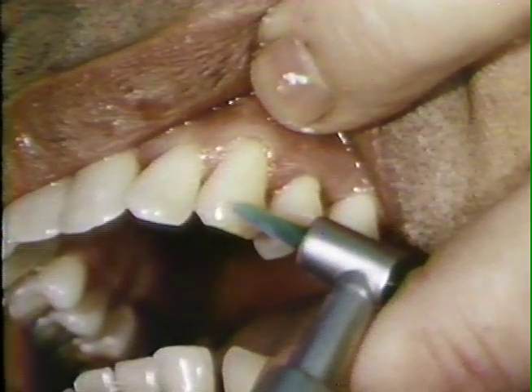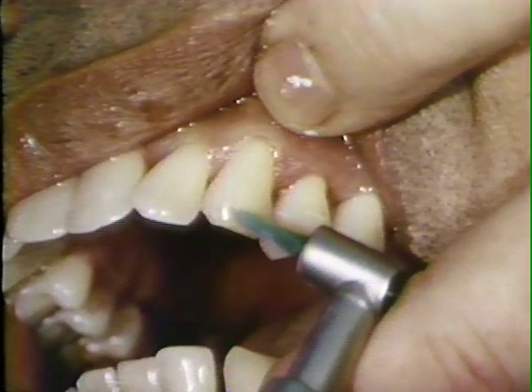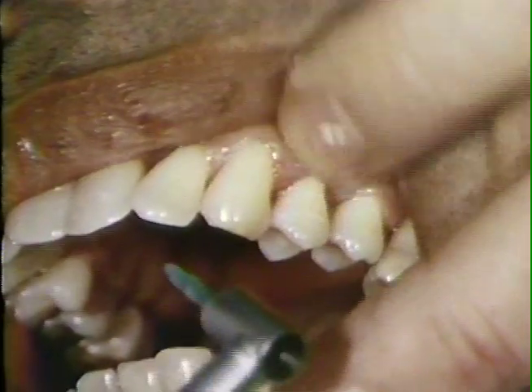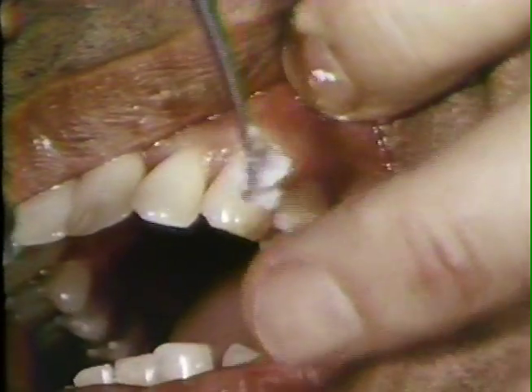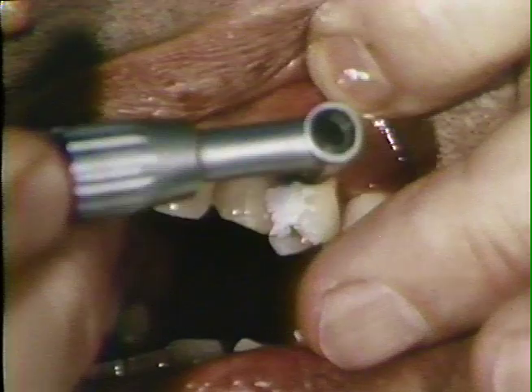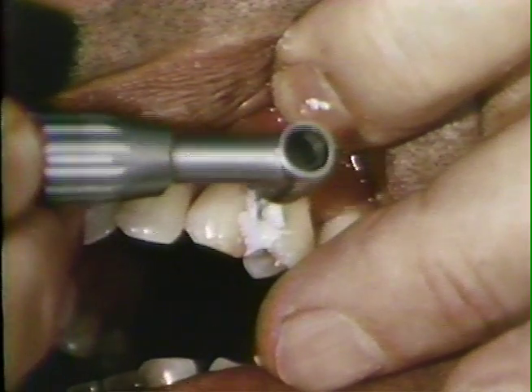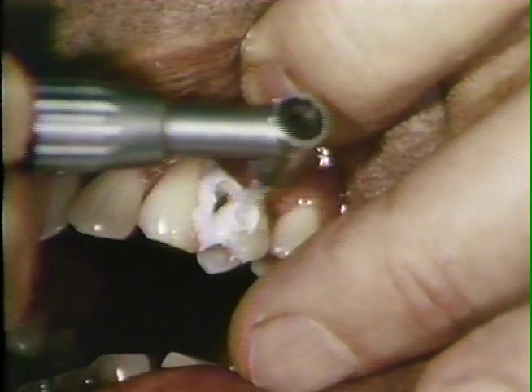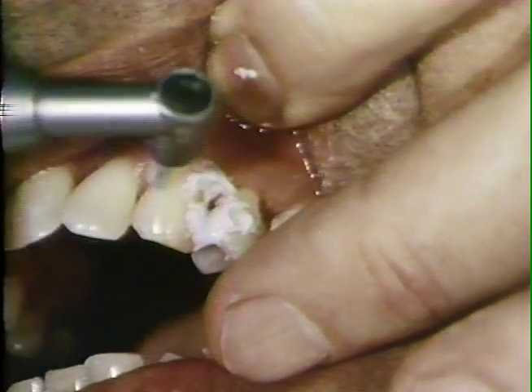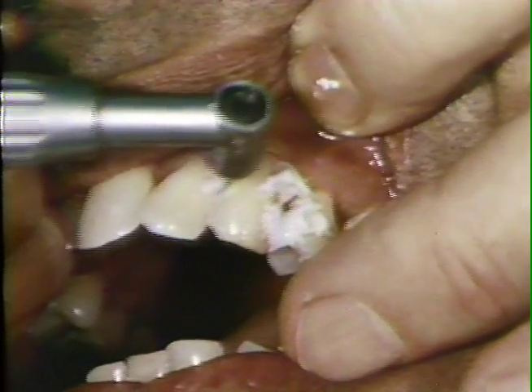The back and forth action of the polishing tip is shown here as it is held against the maxillary cuspid. There is also available a very thin diamond-coated tip that can be used with this contra-angle for the removal of overhanging margins of amalgam or gold restorations. Polishing must follow the use of the diamond abrasive.